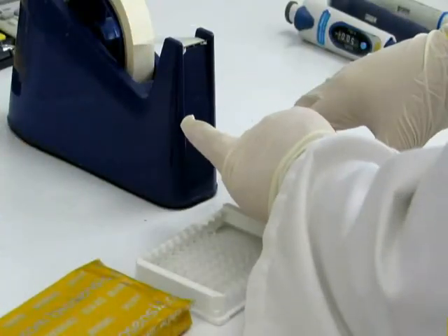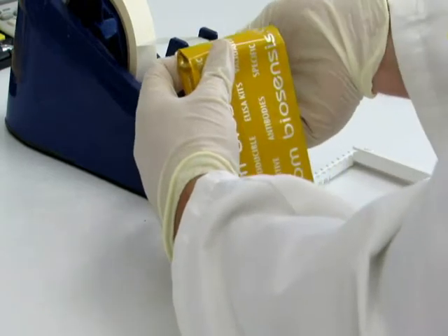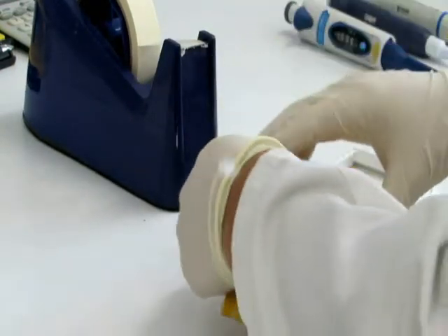Select the appropriate number of strips that you will need for the experiment. You can store the remaining strips in a sealed package in the refrigerator for further use.